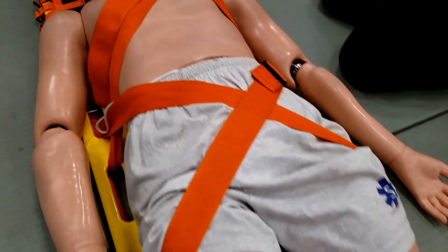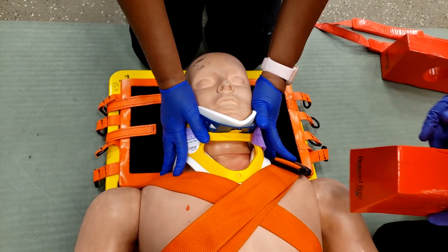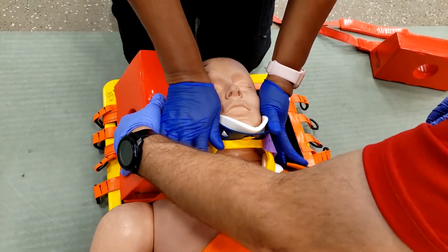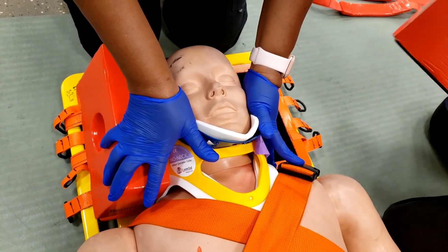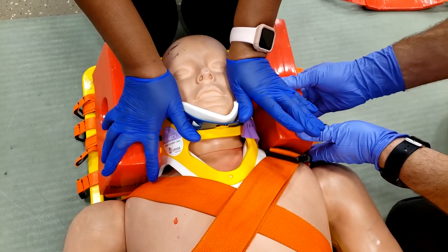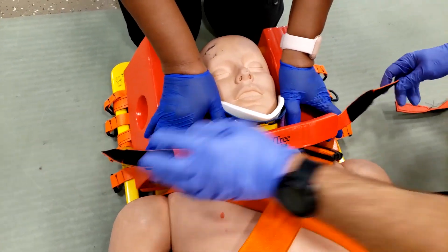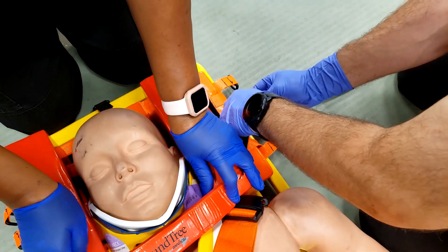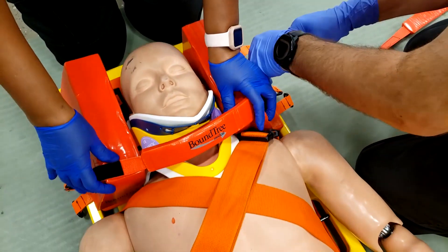Once all straps are secured, you can then place the head blocks, making sure they are making contact with the shoulder and the head at the same time. Place one head strap over the chin and one over the forehead and secure them to the pad on each side of the patient's head.